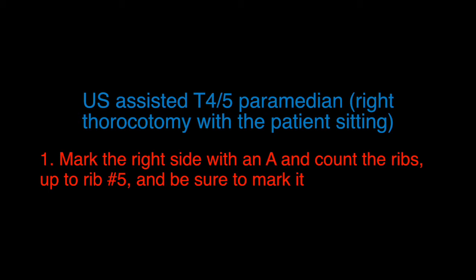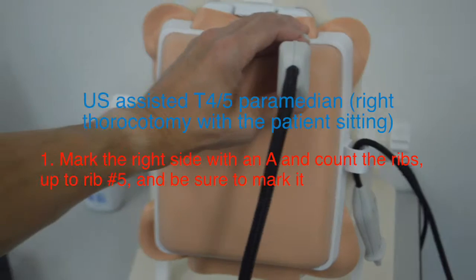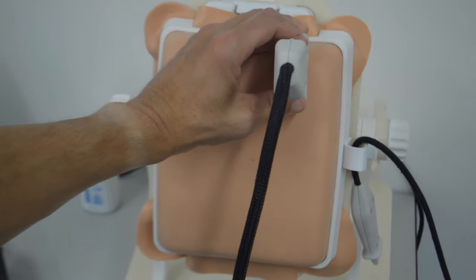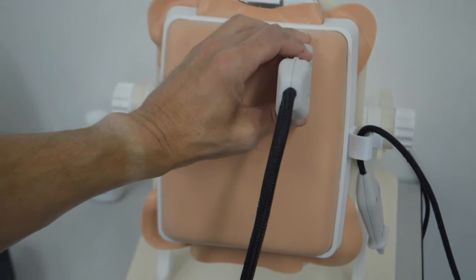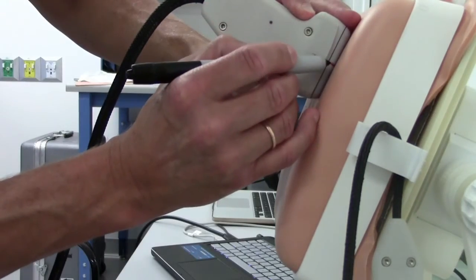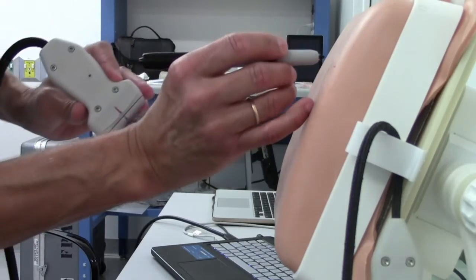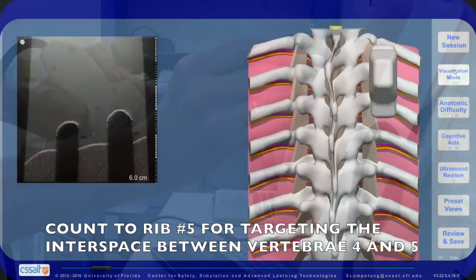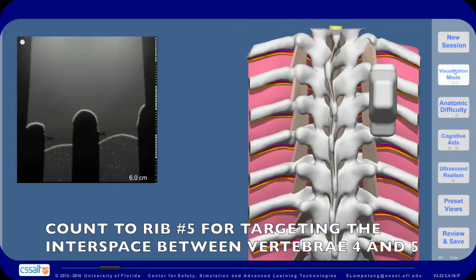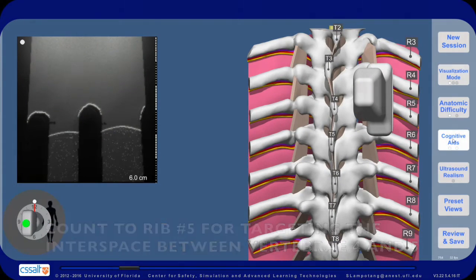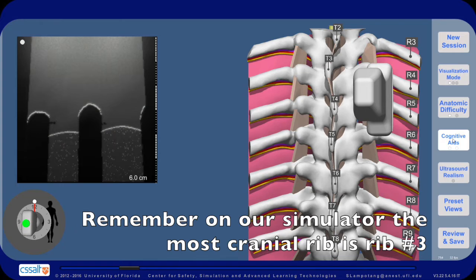Step 1: Mark the right side with an A and count the ribs up to rib number 5, and be sure to mark it. Count to rib number 5 for targeting the interspace between vertebrae 4 and 5. Remember, on our simulator the most cranial rib is rib number 3.